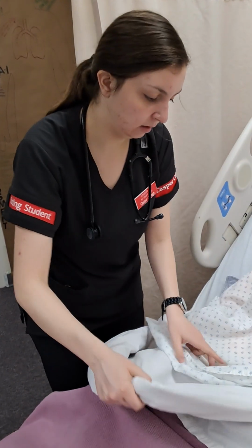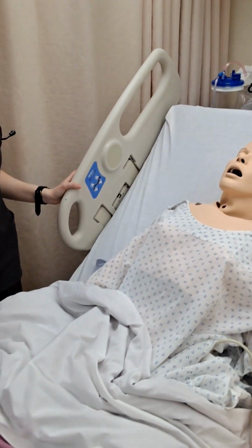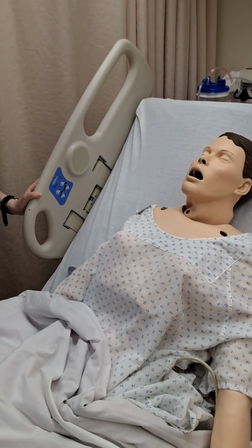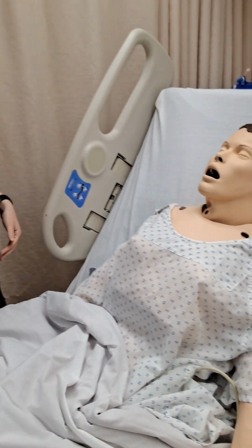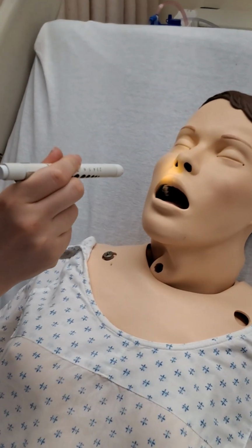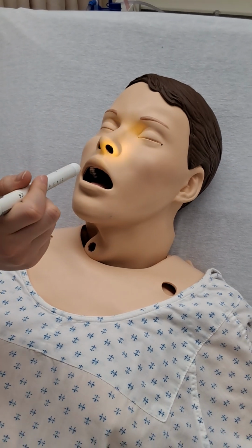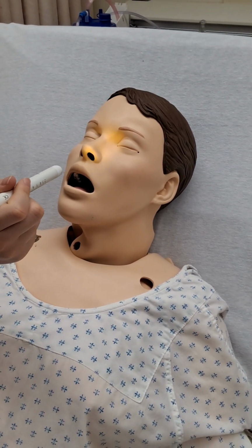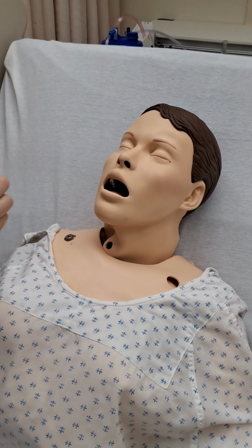Okay. I'm going to replace the gown. Now I'm going to assess his airflow, his skin integrity, and his nares. So I'm going to first do my skin integrity assessment. I see that his nares are clean, dry, and intact, and I see a little mucus obstruction in his left nare and no obstruction in his right nare. Now I'm going to assess the airflow.